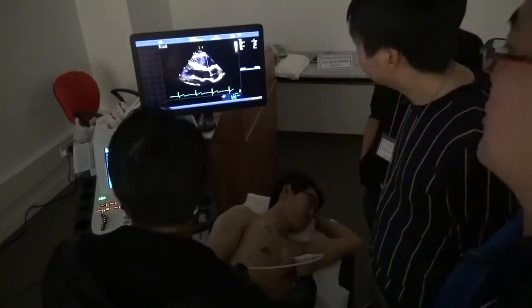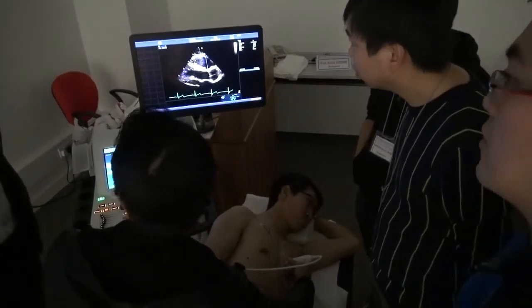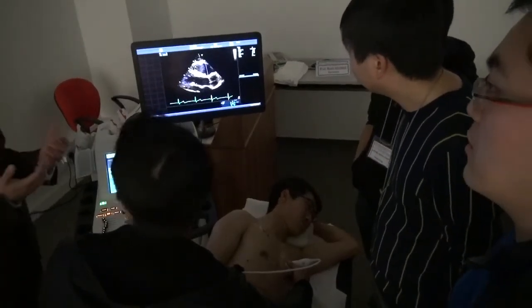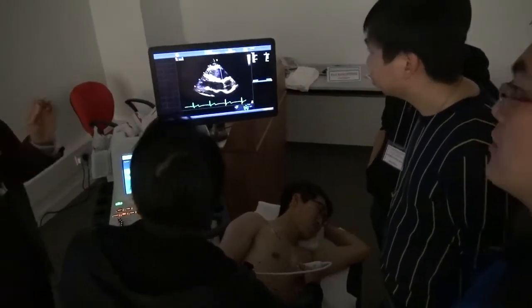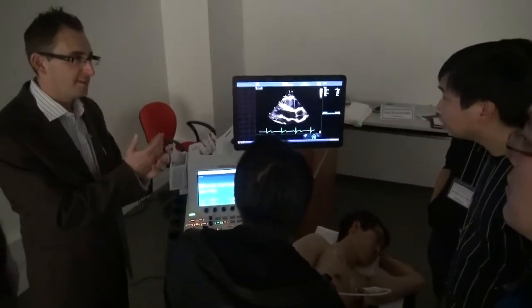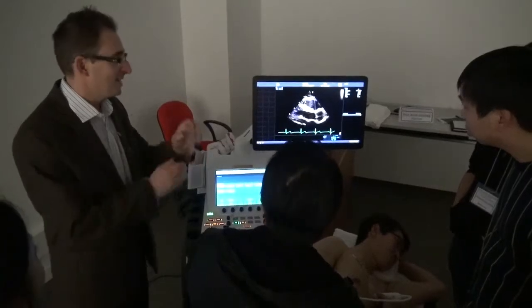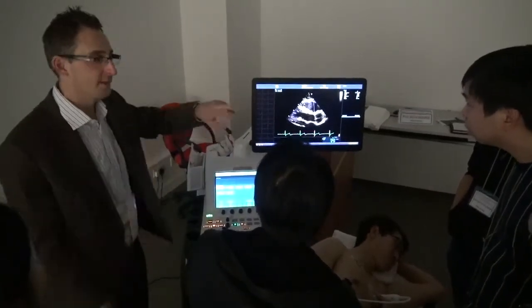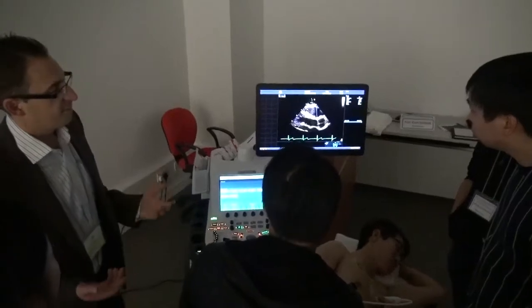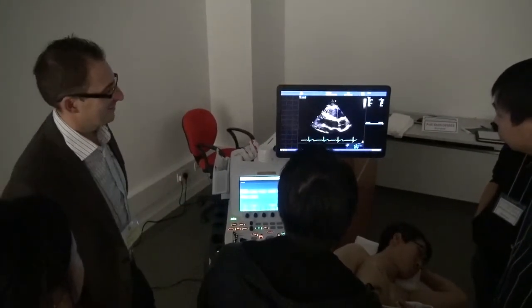And you can see there's already a little bit of inherent variability because I measured 26, you measured 28, I think you measured 24. And this is important because those small millimetres make a lot of difference. And it's about getting that cut absolutely spot on, making sure the orientation is absolutely spot on, making sure you're doing it as you asked it, making sure you measure it in the right place. This is inter-observer variability, and echo is quite high in inter-observer variability.